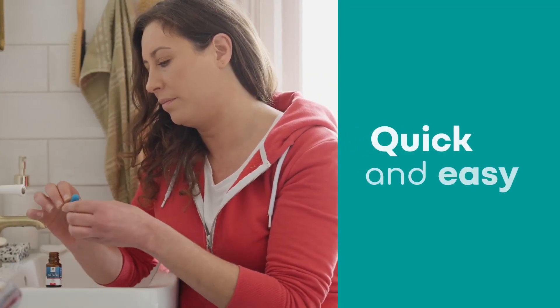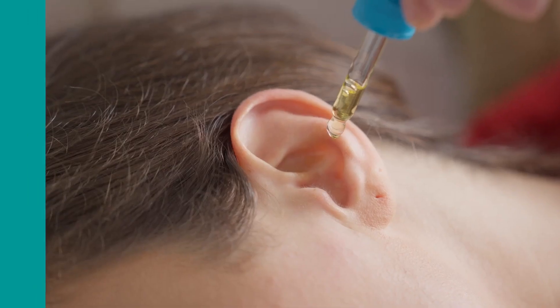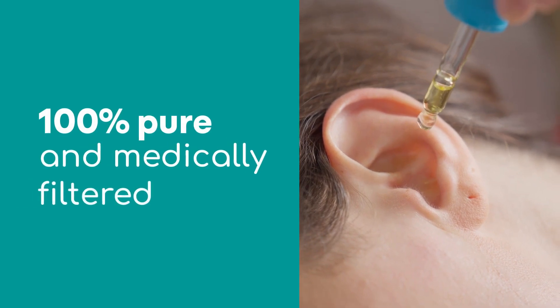First, soften and reduce build-up seven days prior to ear washing with our 100% natural and medically filtered olive oil eardrops.